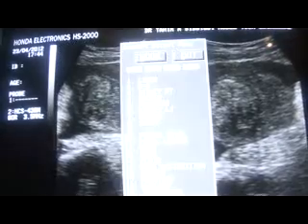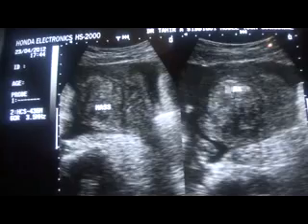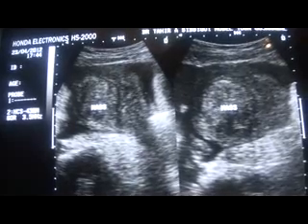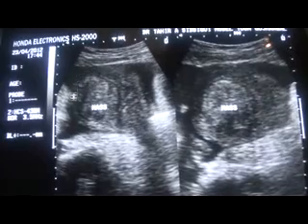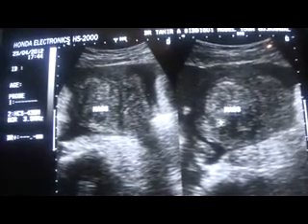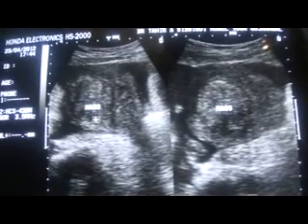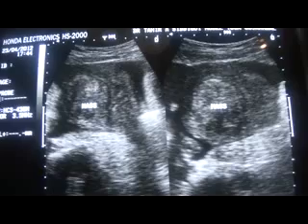This is the endometrial canal, and this is the fibroid. The endometrial canal, rather than going straight, is curving around this solid echogenic area with internal cystic areas, which is a fibroid.